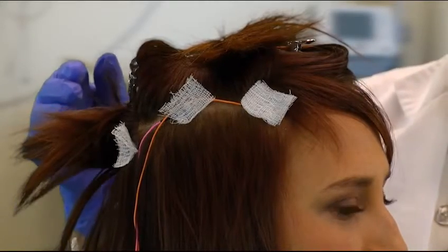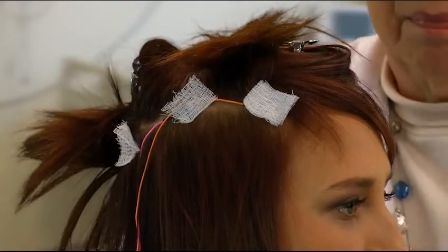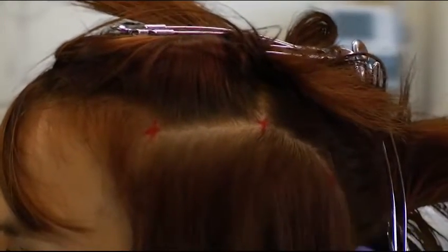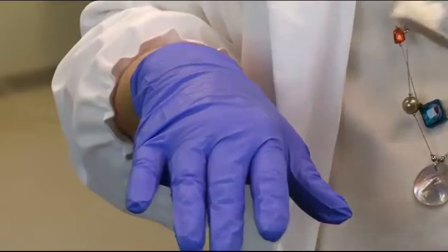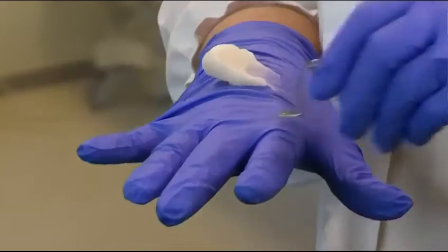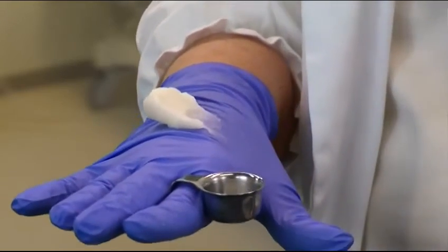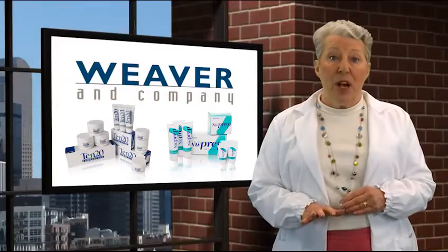The patient's head has been measured and marked in the usual 1020 fashion. As you see, I've already placed a few electrodes. On this side, I have parted the patient's hair so that I can see more than one electrode position at a time. Then I put about a heaping tablespoon of 1020 on the back of my non-dominant hand and placed the pumice cup between my thumb and index finger on the same hand. Now it's time to put on the electrodes.